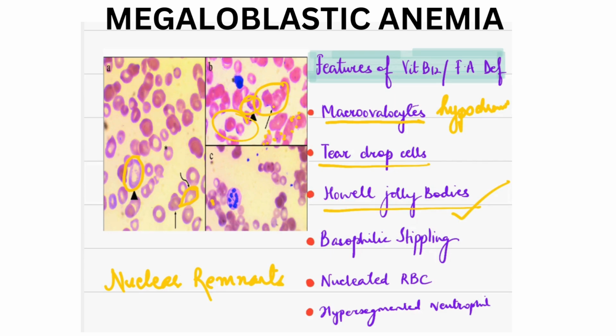which can be because of vitamin B12 and folic acid deficiency, or sometimes because of intrinsic factor deficiency, or if a picture is just limited to the peripheral smear and it is not affecting bone marrow, then it can be because of alcohol and other factors also, like drugs, or sometimes it can be because of hepatic disorders.